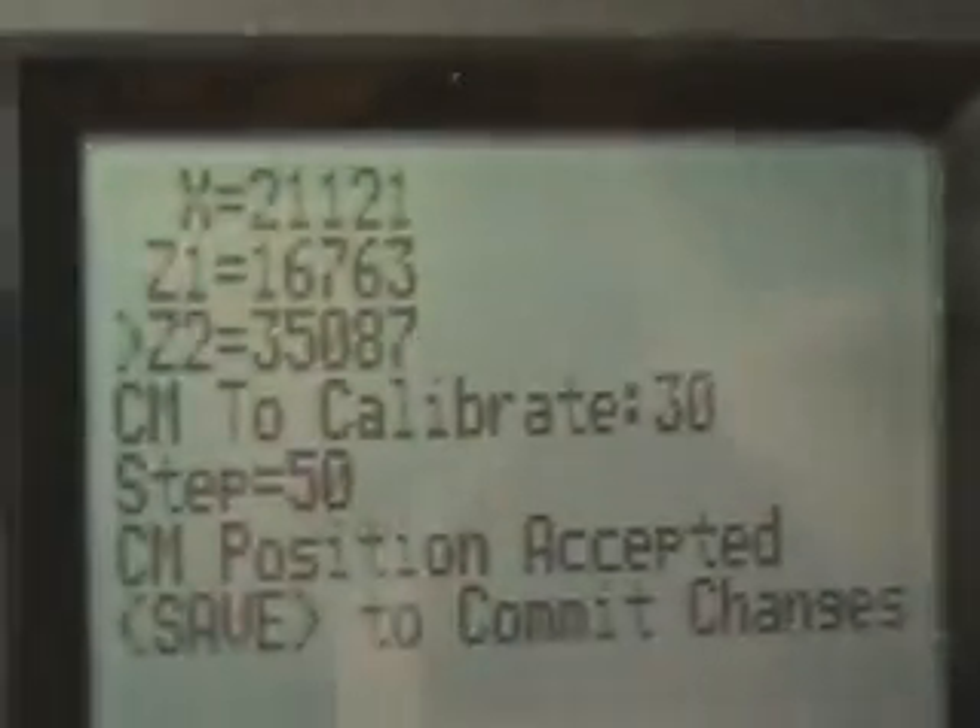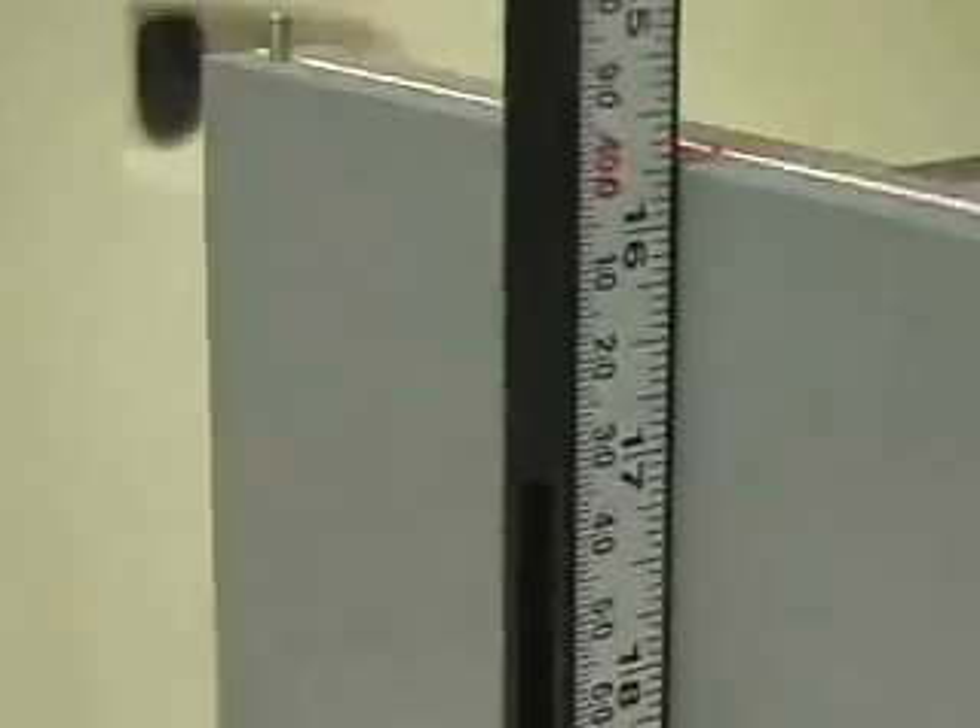Once we're at the 30 centimeter — 30 centimeter to calibrate — at that 200 point. There's the 30 centimeter. Once we're there at the top of our calibration points, then we just tell it to go to zero using the middle button. Go to zero. The laser will drive down to zero, and once it's there at the zero point, then you hit save on the hand pendant.